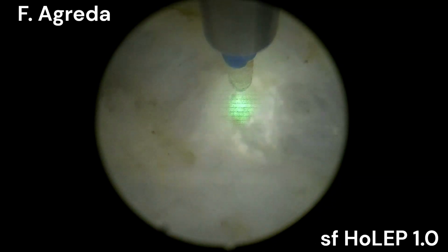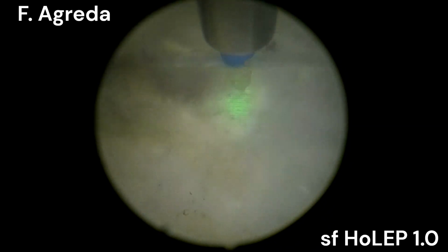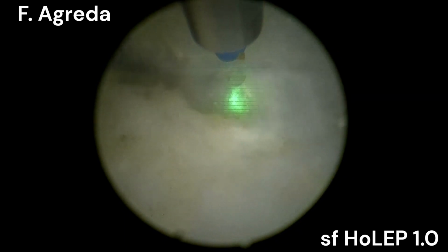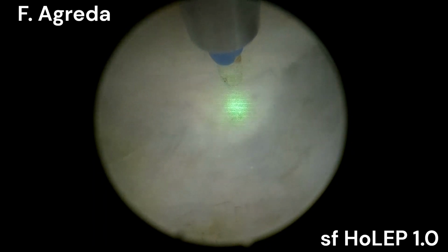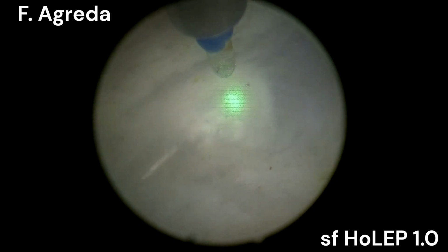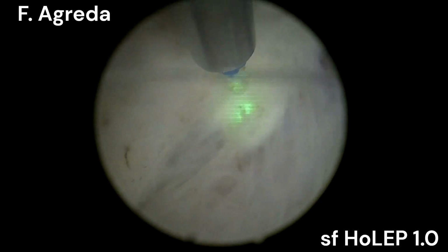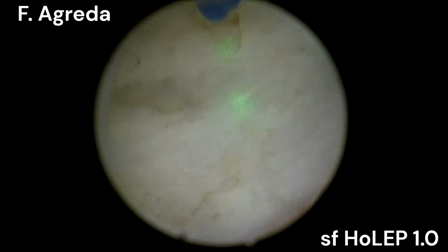because here the capsule is very thin, and you go, let's say, in an ascending fashion, and it's very difficult. You also have this kind of leaf of capsule coming from the verumontanum, and it can be confusing because the lateral capsule, the capsule coming from the lateral lobes, is not the same leaf that comes from the verumontanum. So as you can see here, this one is very superficial from the verumontanum and deeper, as you can see here, coming from the lateral. So you have to be very careful what you're aiming to and what your progression is.